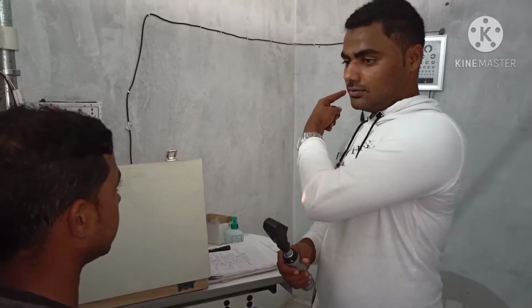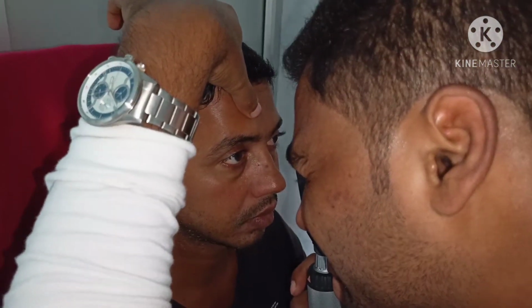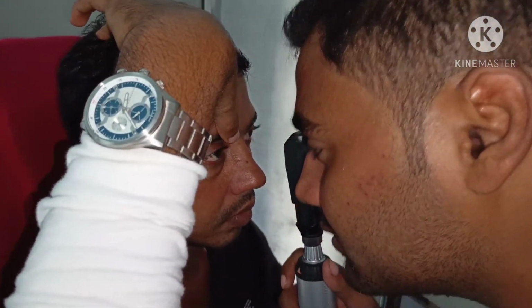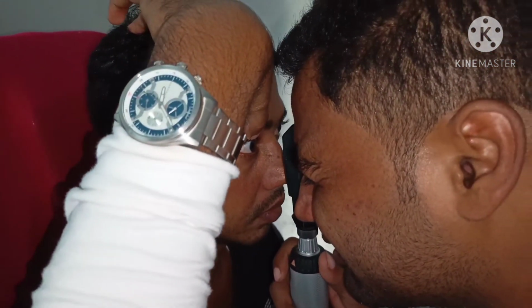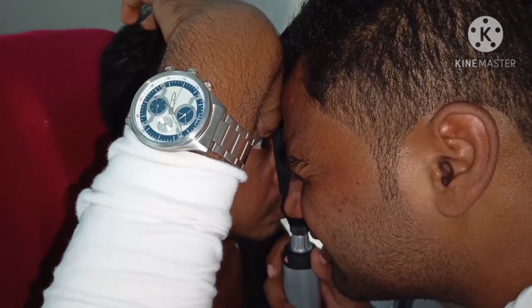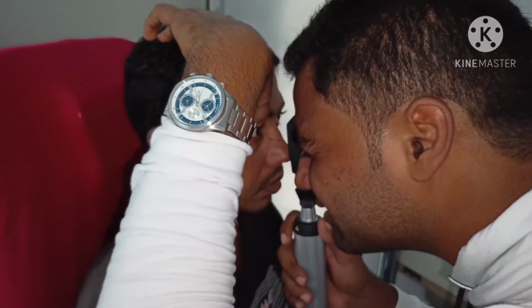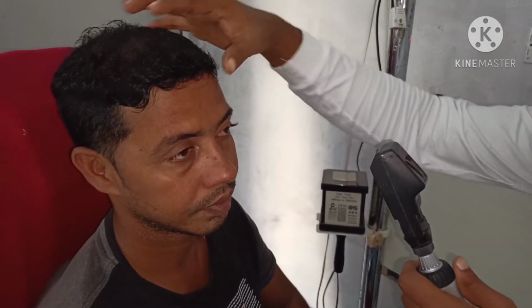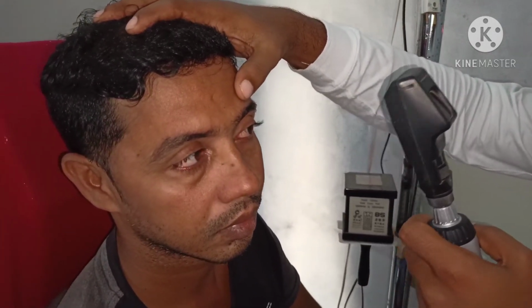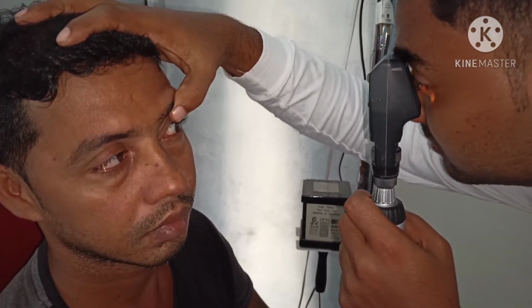Examine the eye of the patient with the ophthalmoscope. Examine the right eye of the patient with your right eye and right hand. With your left hand and left eye, examine the left eye of the patient.